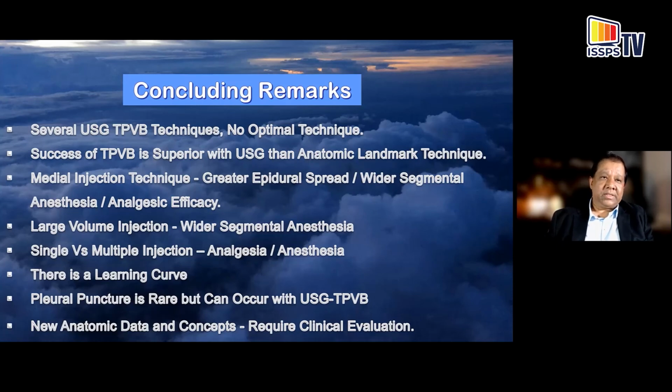Medial injection techniques produce greater epidural spread. There's wider segmental anesthesia. Also, clinical efficacy seems to be better than lateral injection techniques. This is easy to understand based on the anatomy and the afferent nociceptive blockade that you can provide. Large volumes seem to be more advantageous than a smaller volume injection. But then it depends again whether you're performing a single level or a multi-level injection.